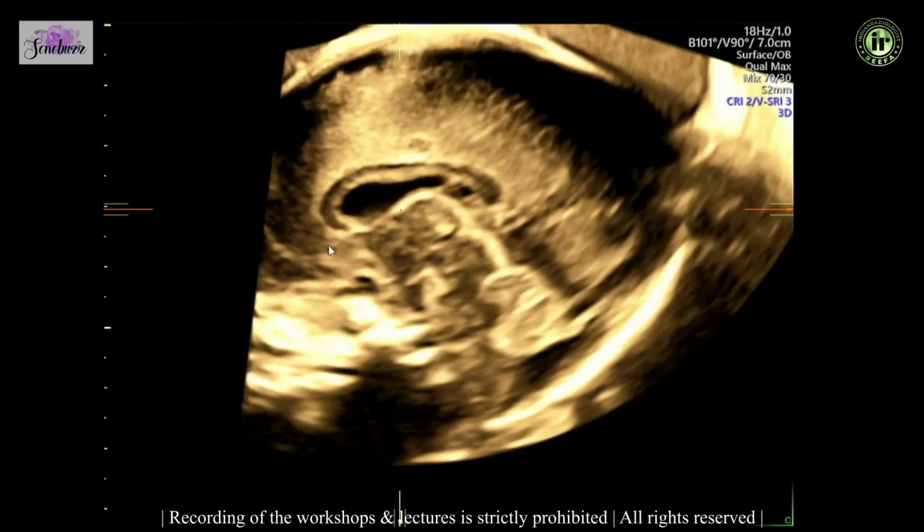So we identify the midline section by the presence of the corpus callosum and the cavum. That's the tectal plate. This is the midbrain. That's the pons, the medulla oblongata. This structure here is the fourth ventricle here, and this is the vermis here. You can see the fissures. That's the fastigium, and that's the tentorium here.